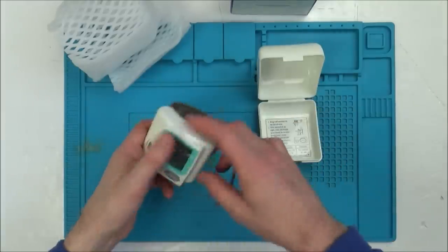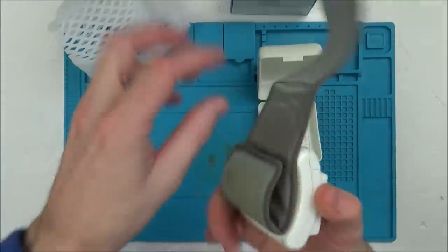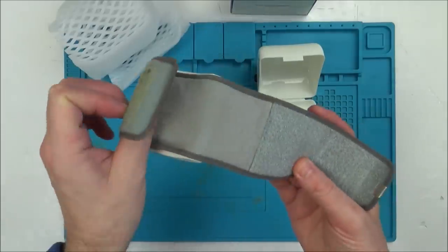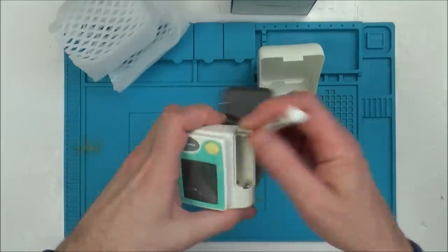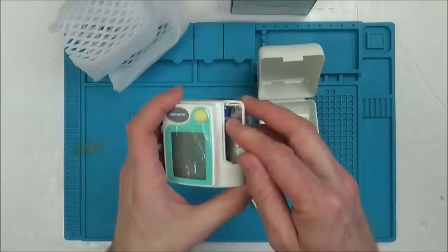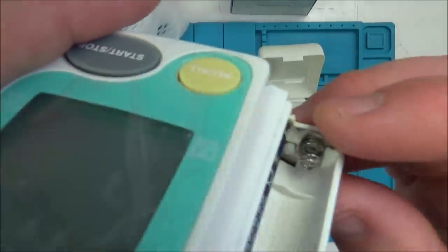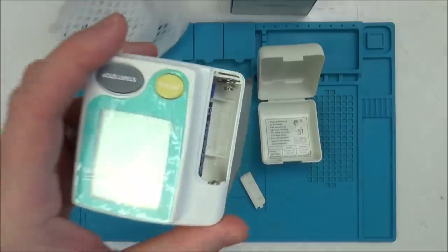So here it is. It does just work on the wrist, not the arm. Needs a bit of a clean. The battery compartment looks a bit dirty but it's okay - a slight little sign of corrosion just up here but nothing too bad.